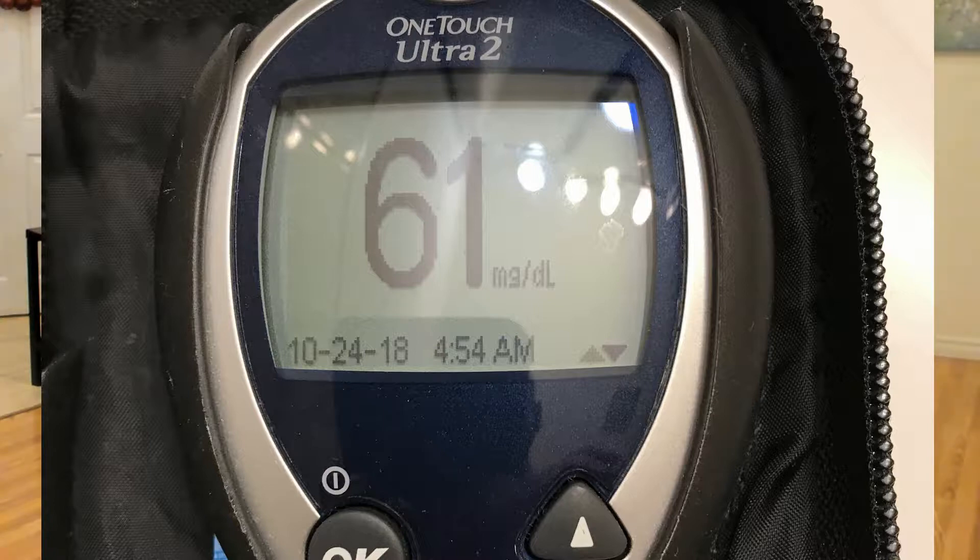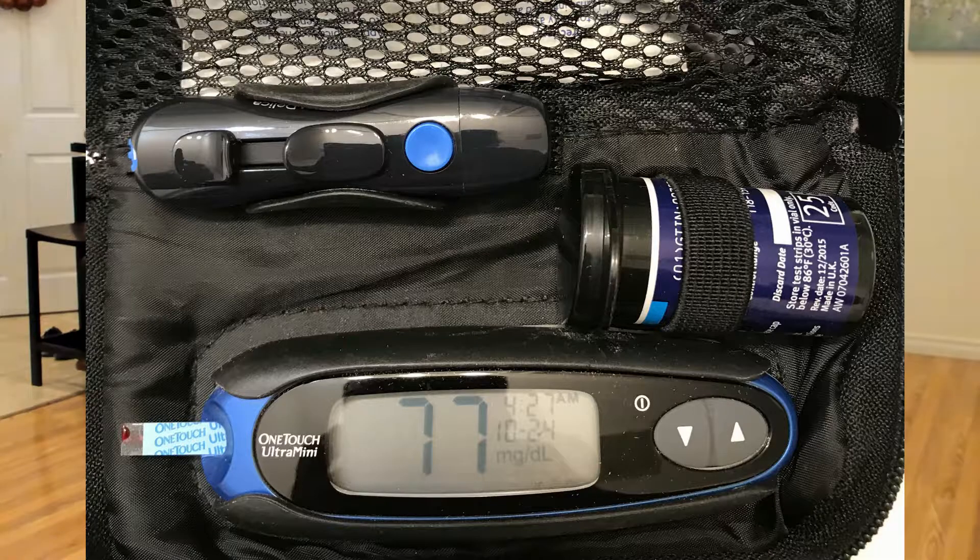I took a picture of two examples of my meters taken yesterday morning — first thing in the morning — and you can see the difference: one is at 61 and one is at 77. That's just to remind you again that glucose meters are designed to give reasonably accurate test results.